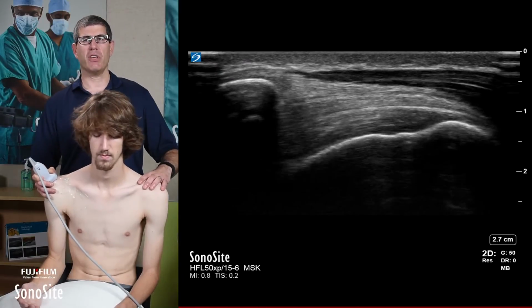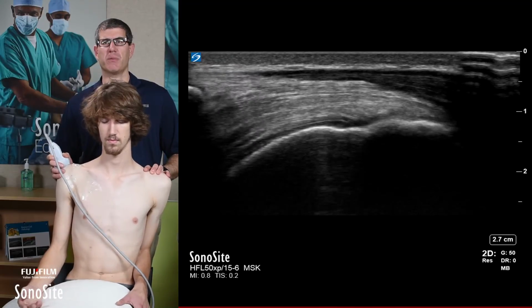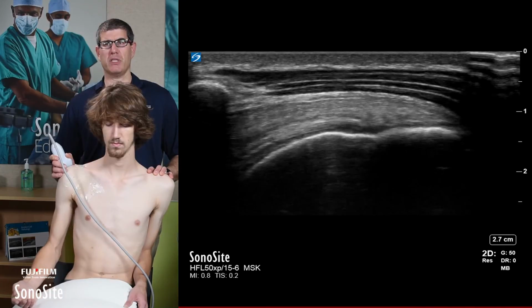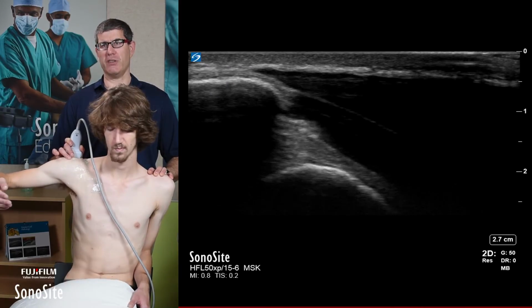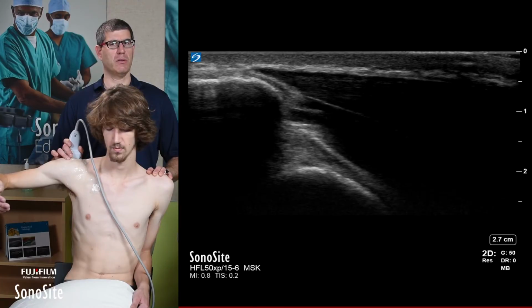Okay, can I now have you go into a scapular retraction? Okay, boom, I can see that really opens up the tendon. There's a lot more tendon that's visible. Now, if you can start bringing your arm into abduction again, keep going, keep going, keep going. Good, and I see I just bought him an extra 30 degrees. Sweet. Okay, bring it back down.